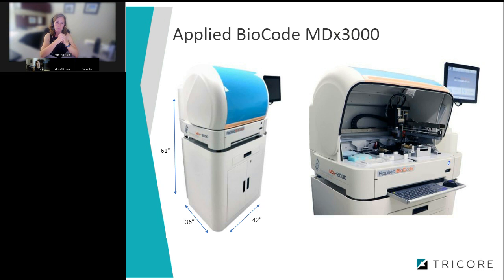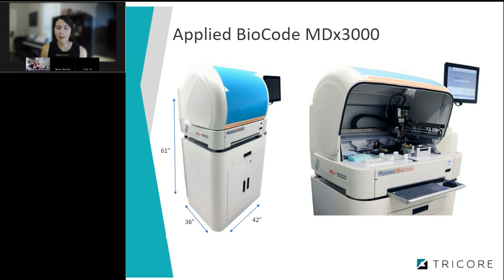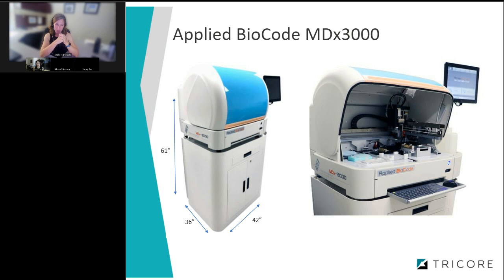And does stool processing for 96 samples increase the processing time by a lot? About how much time would you need? Yeah, so you're going to have to pipette from each of those samples into an extraction plate. So if you can picture pipetting from 12 samples versus 94, it's going to take quite a bit longer. You're unscrewing a lid, pipetting, screwing the lid back on.